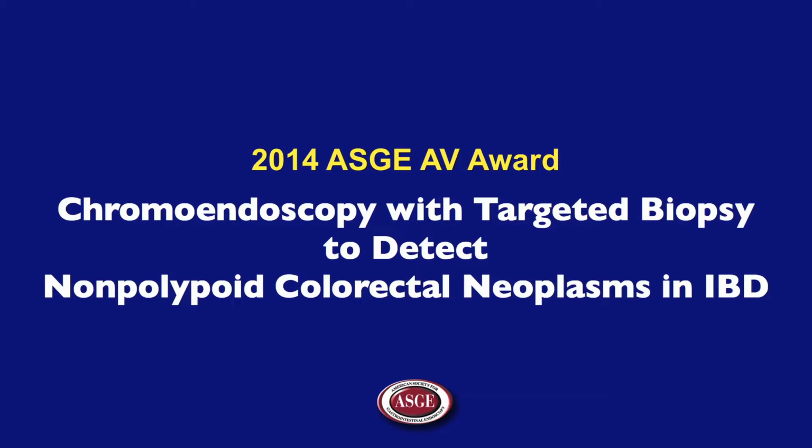Chromoendoscopy with targeted biopsy to detect nonpolypoid colorectal neoplasms in inflammatory bowel disease.